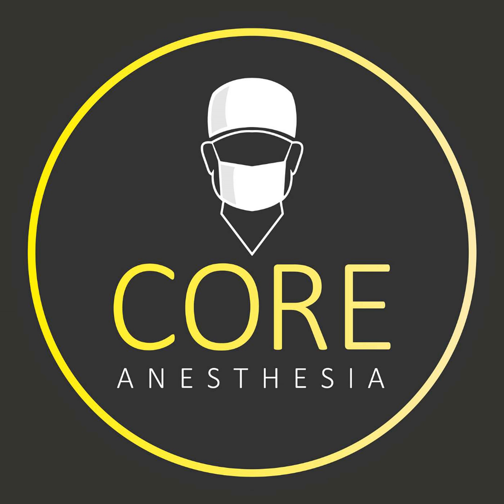Number three, the patient is usually in the lateral or even semi-prone position, facing toward the endoscopist and therefore usually away from the anesthesia provider. Number four, a plastic bite block is placed between the upper and lower incisors. This is another foreign body in the upper airway and can also dislodge loose teeth or push the tongue into an obstructing position. And then number five, the room lights are turned down or off so that the endoscopist can better see the endoscopy television monitor screen.